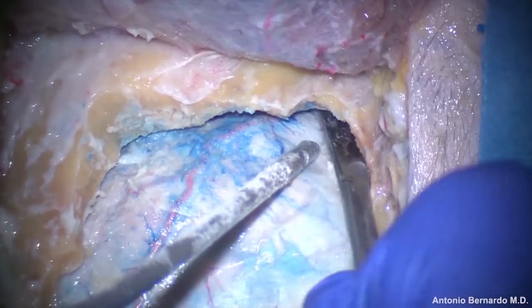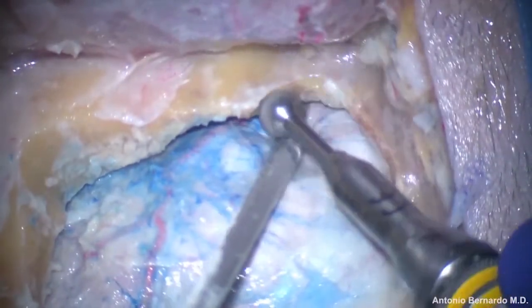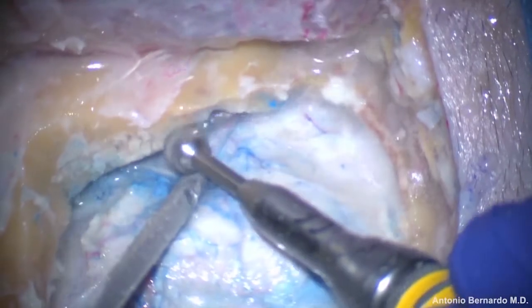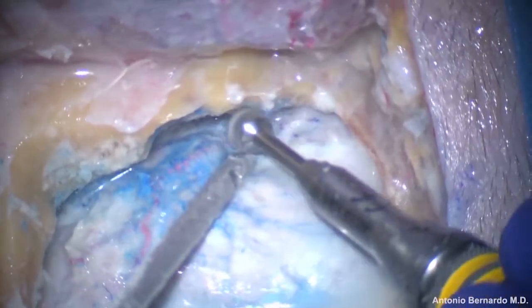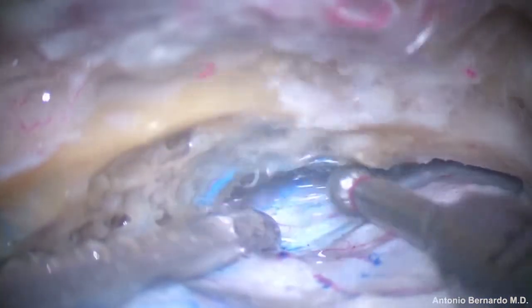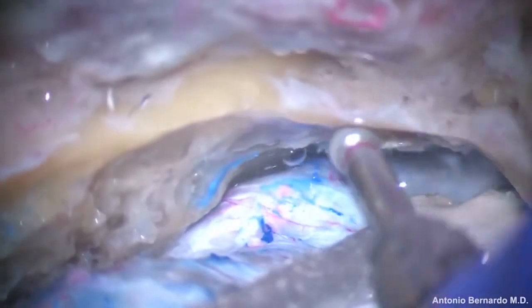The dura is detached from the middle fossa floor. Using a large 4 or 5 mm cutting burr, the bone is drilled away until it is flush with the floor of the middle fossa. Any bony spur is drilled away until there is no obstruction to the middle fossa floor.